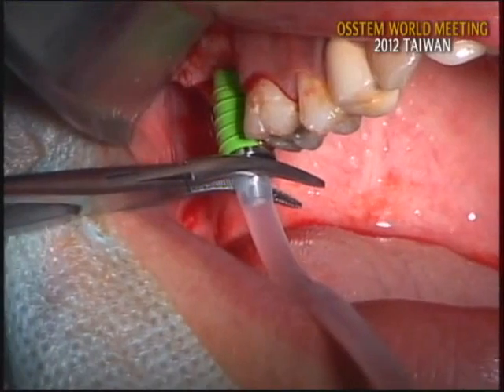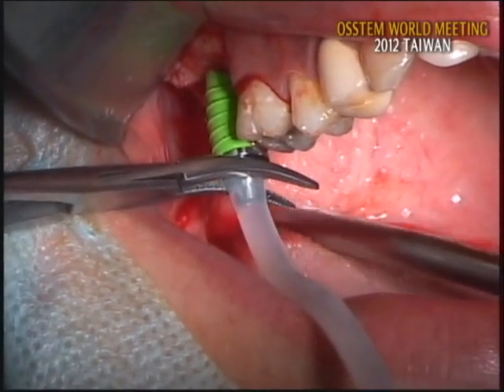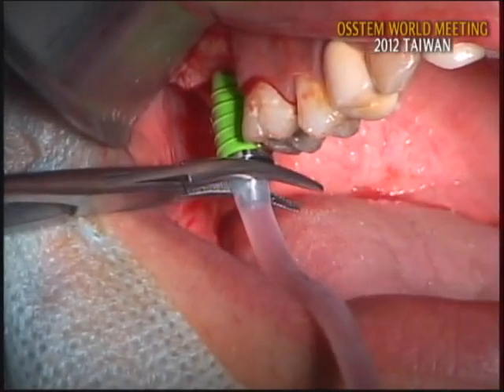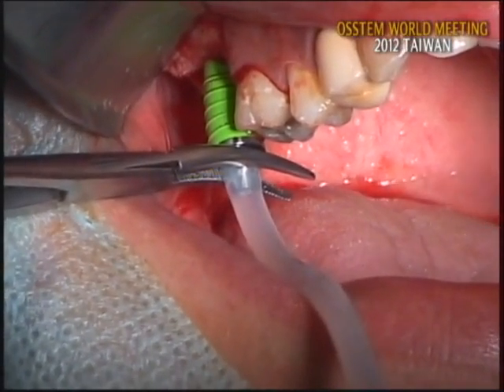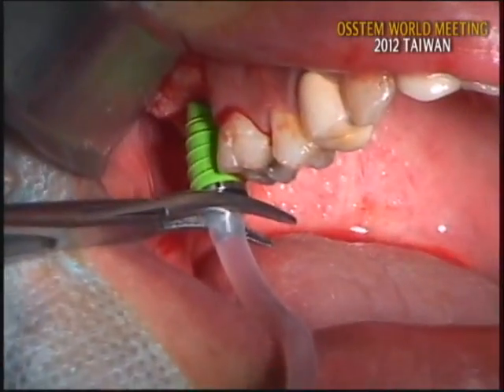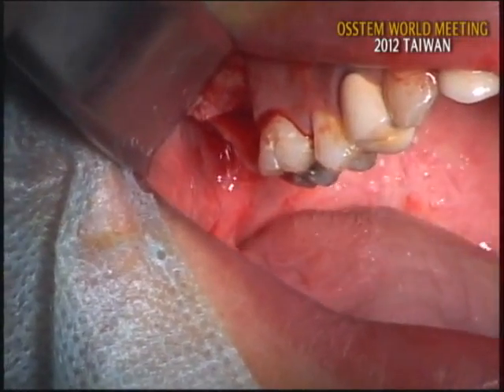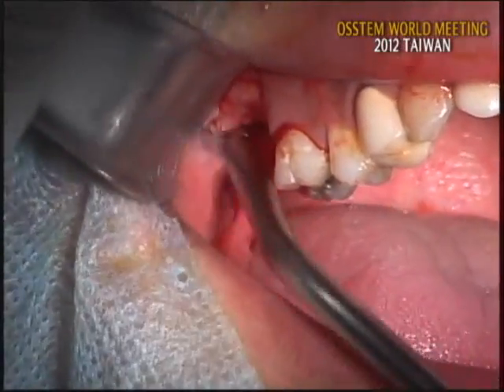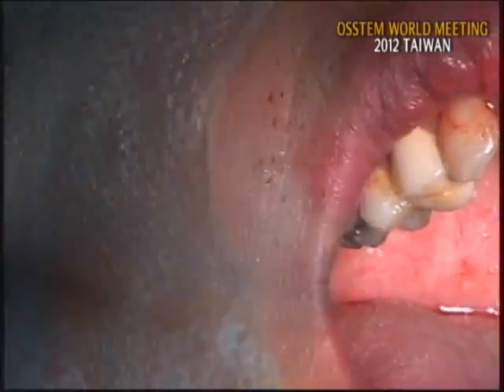I'm gradually increasing the amount of solution, 0.5 to 1.5 cc, and retrieving. And then I'll inject the total solution. I think it's very successfully detached. Good. Now the sinus floor has passed and the membrane is safely, widely detached. So the next step is bone grafting.